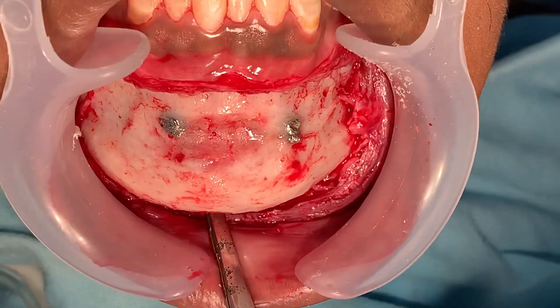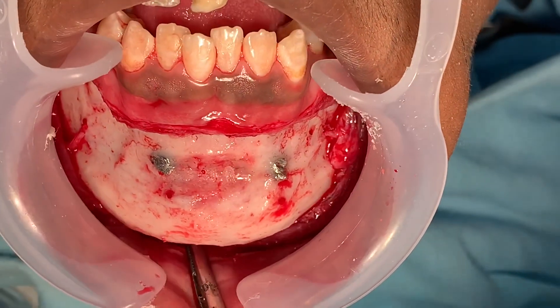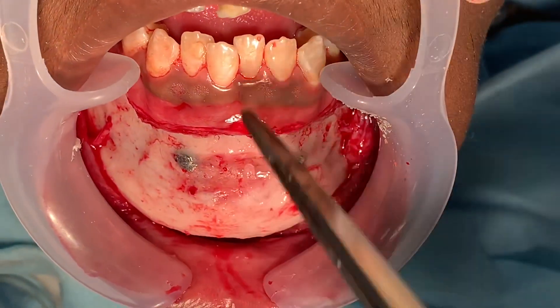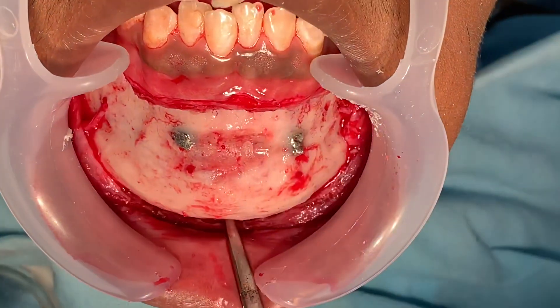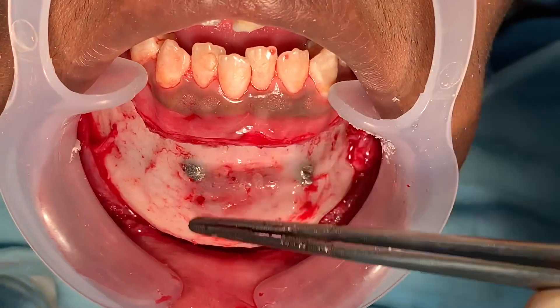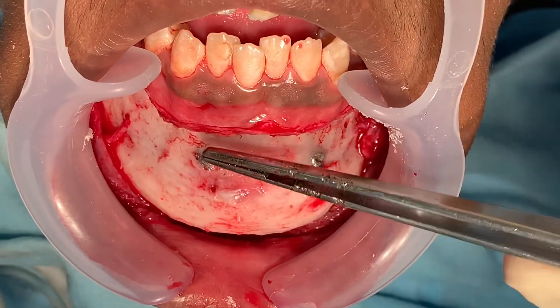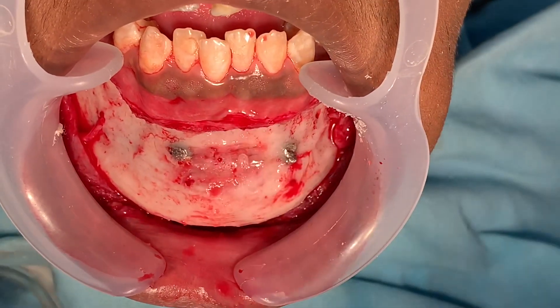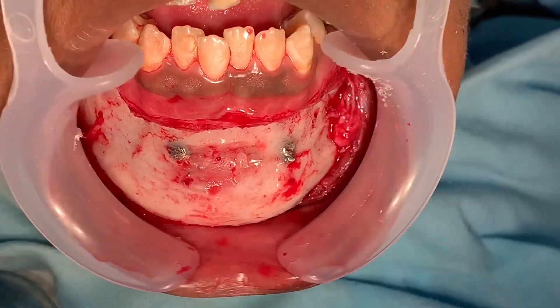This patient is 19 years old. I want to give him a broad chin, but the vertical height was a bit too much for him, so we've taken down a bit of that. He had a very straight chin, so I've created this mentolabial fold — the chin will adapt there and we'll give him a nice fold as well.